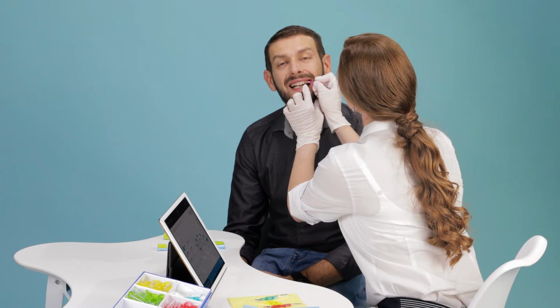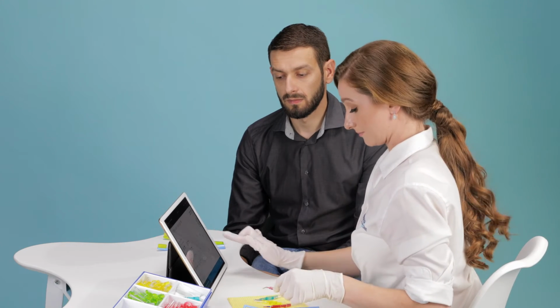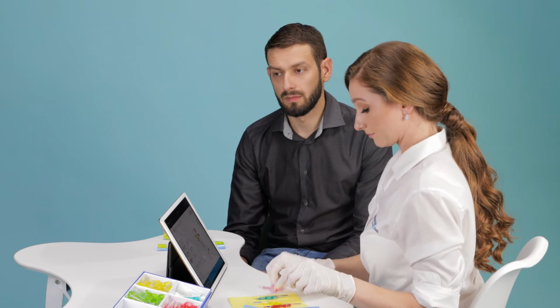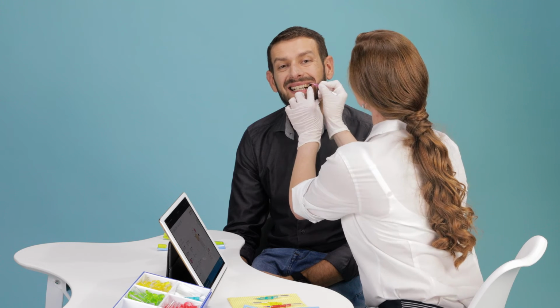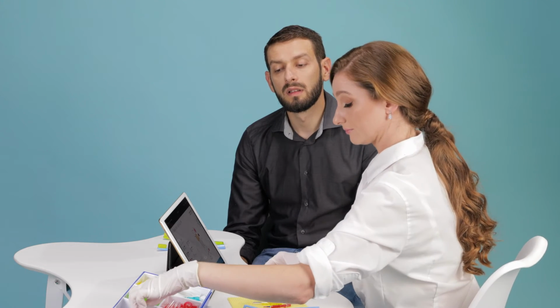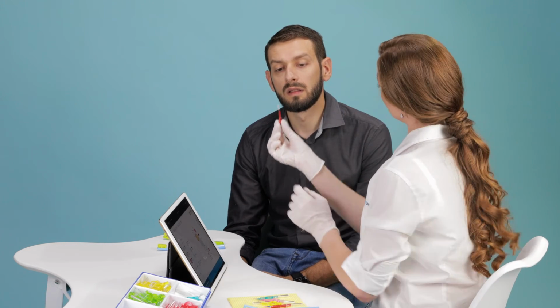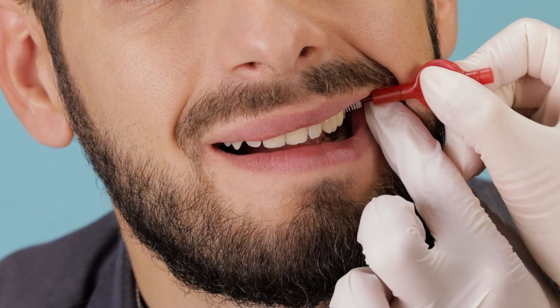Moving on to the upper left sextant, I check and measure inflammation with the prime pink brush. However, in one area it is necessary to use the red Perio 405 brush, as this is the correct and necessary size here.